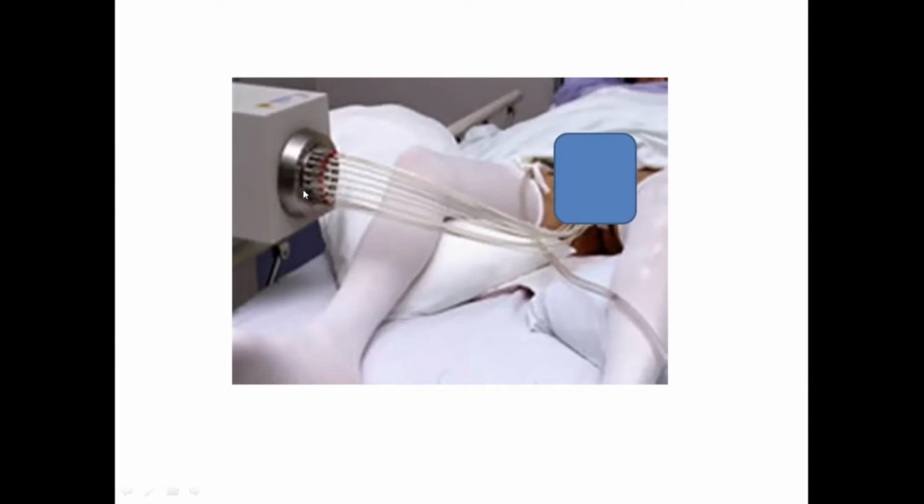And the radioactive source is on the end of a long cable, and that long cable then forces its way down through each of the cables into the plastic tube in the prostate, one after the other. And each time it goes into the prostate, it then loiters for a few seconds in different positions to emit the radiation in as accurate a way as possible.